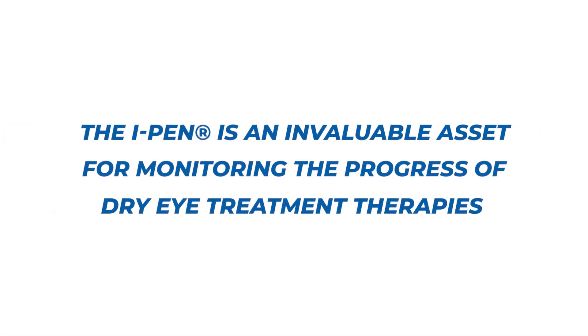The eye pen tear osmolarity system is an invaluable asset for eye care professionals to monitor the progress of dry eye treatment therapies.